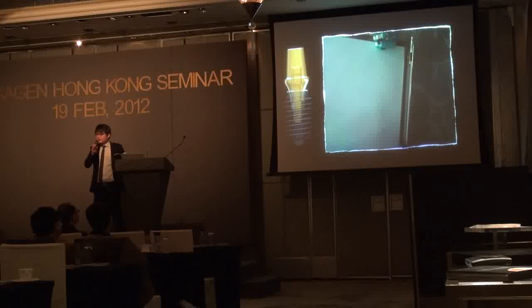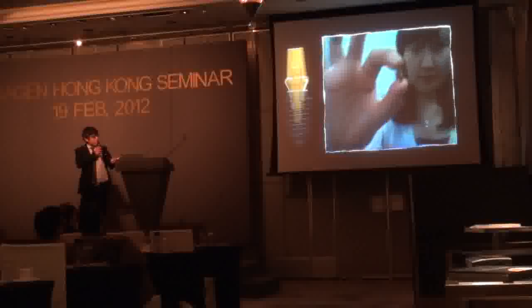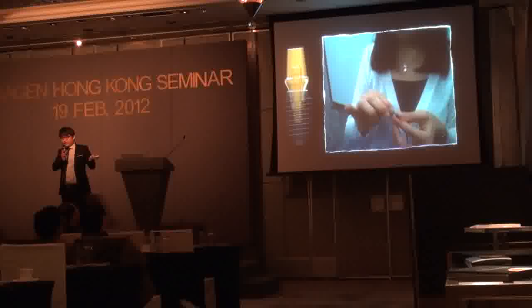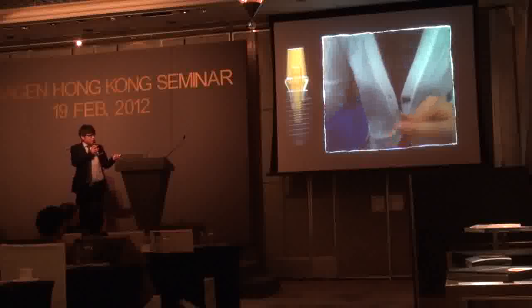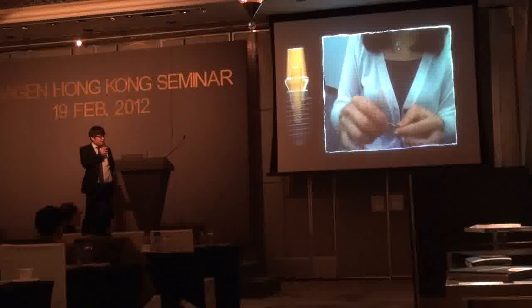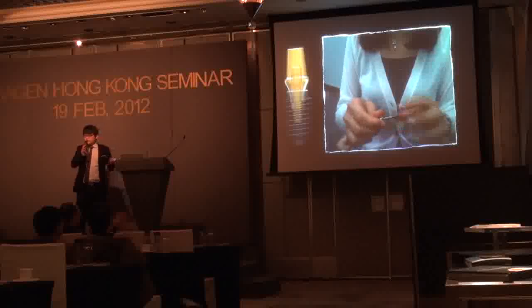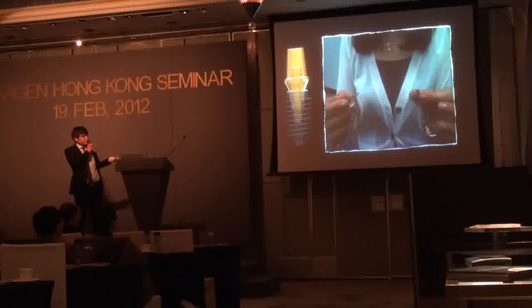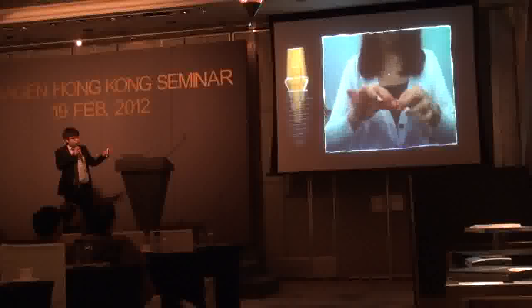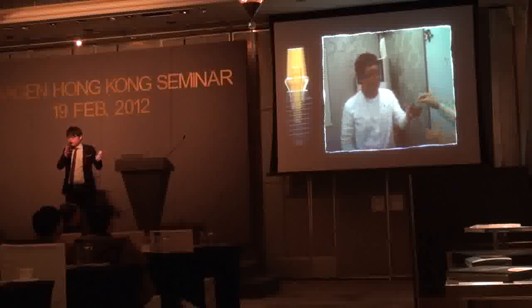I tried this with my colleague in our office in Korea. As you see here, she connects the abutment and the fixture with just finger force, which is less than 5 newtons. She connects the screw in, then takes out the abutment screw, so there is no screw on it. She tried to take out the abutment, but she can't.